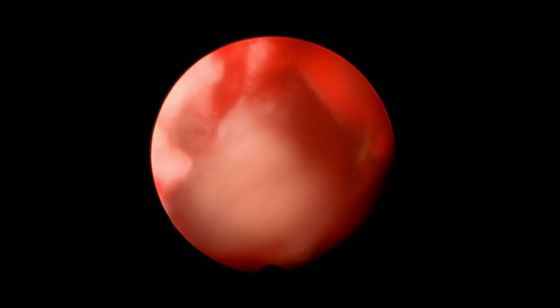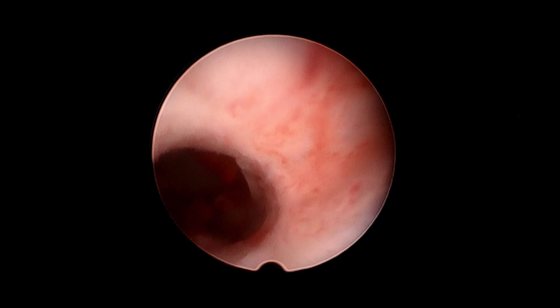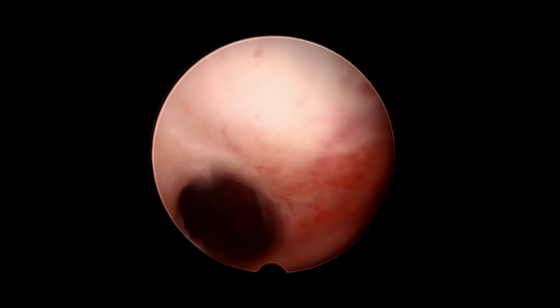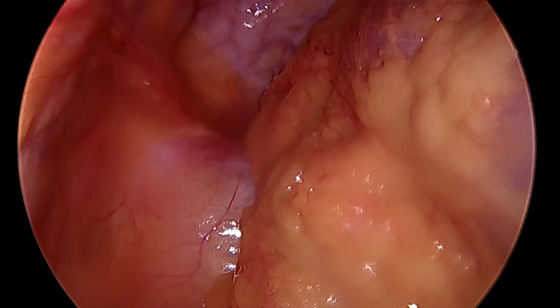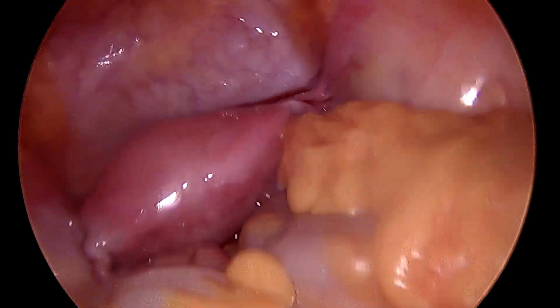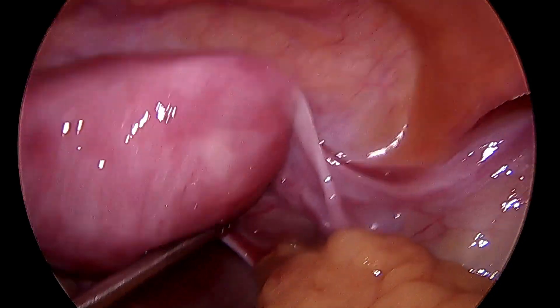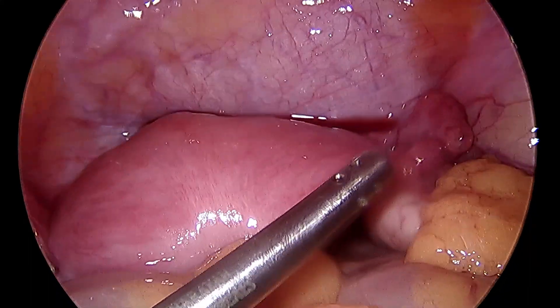The septoplasty is now over. You can see both ostia are at the same level as the fundus and the cavity is nicely open. You can see the internal os ring right in front of us; as you come out you see the cervical canal, meaning the cervical portion of the septum is kept intact. This will prevent cervical incompetence in future and decrease the chances of preterm labor or preterm delivery. Post procedure, we put the Foley's balloon inside the uterine cavity for 10 to 14 days. This is the post-septoplasty picture of the uterus, showing the broad-based fundus.